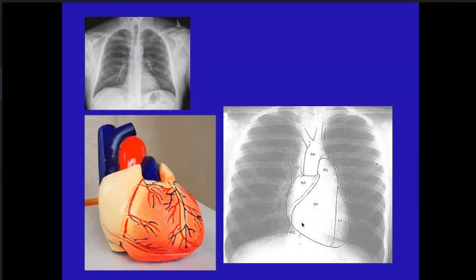And of course, the right ventricle leads to the pulmonary artery, which is well shown here. So now you can correlate a simple straight chest X-ray with the cardiac structure, and you also know where the expected chambers are. I showed you a pacing lead last time, which was perforated, if you remember correctly, and the lead was almost till here. You remember that X-ray? Any of you?